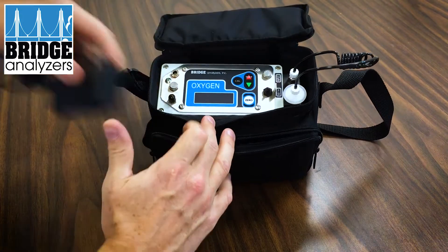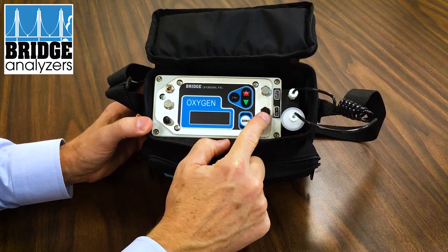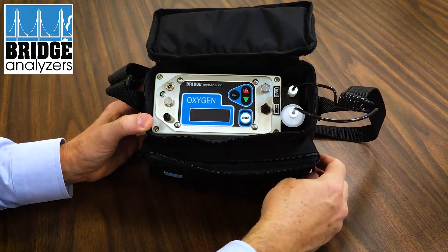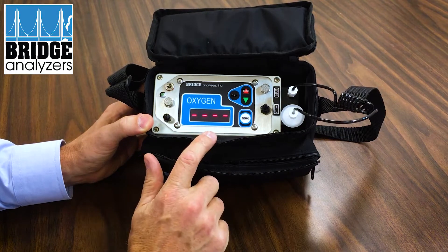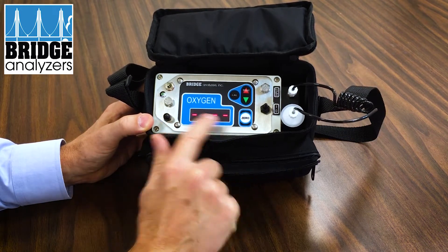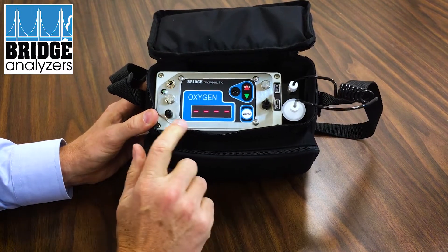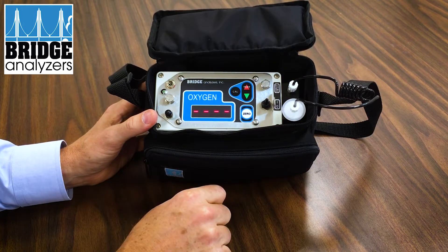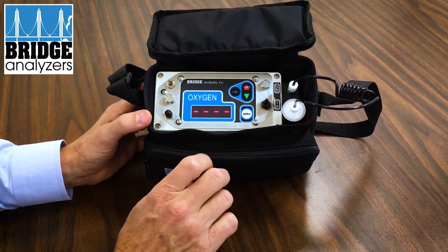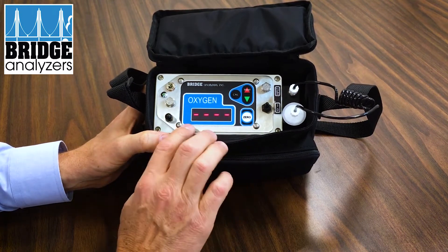There's a power switch right here. If you turn that on, you'll see that the analyzer will display all eights and then go to dashes. You'll also notice that the pump motor ran for several seconds and then shuts off — this is normal operation. You are now sitting with all dashes; the unit is waiting to be zeroed.